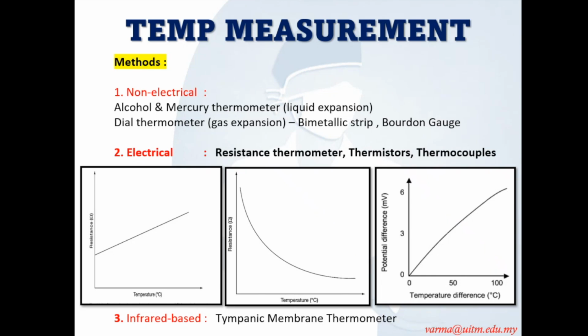These graphs are taken from the podcast primary as well, and they've explained very briefly what is important and needed for Viva. You should be able to draw this and explain the principle. This one, resistance is directly proportional to temperature change. This is inversely proportional. This is also directly proportional, but the resistance thermometer does not start from 0 for a specific reason, whereas the thermocouple starts from 0. And then you must know where these are used.